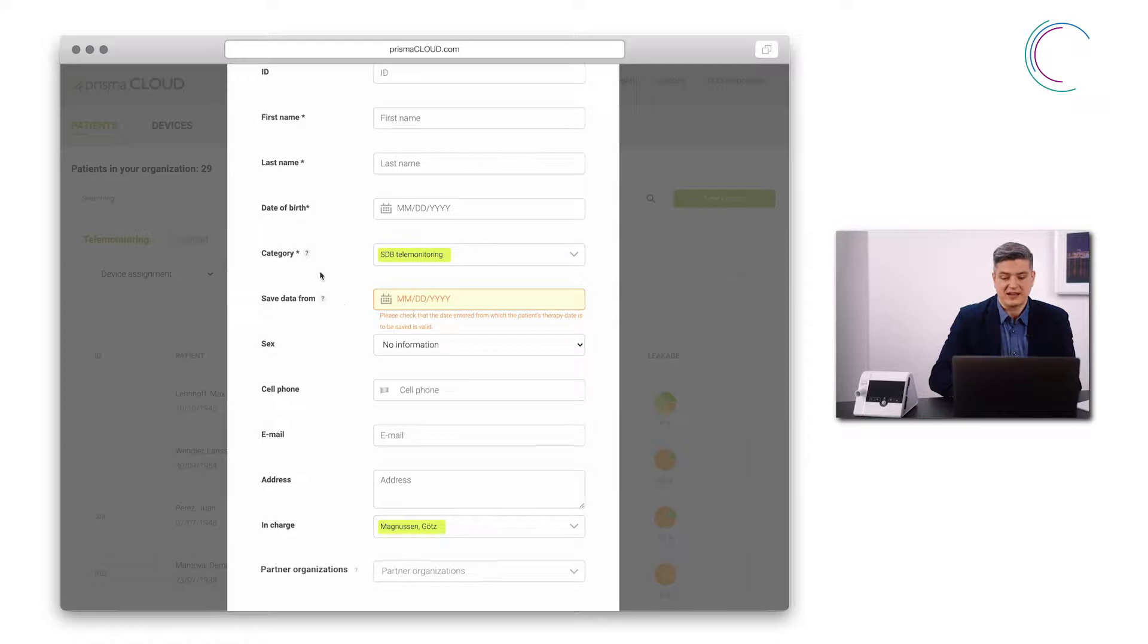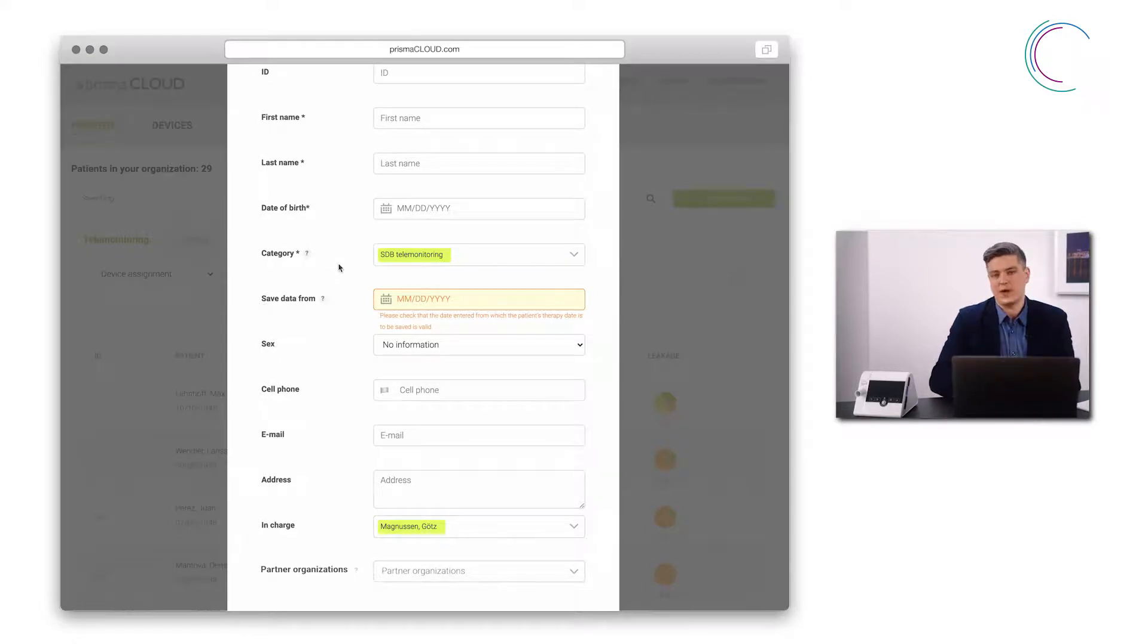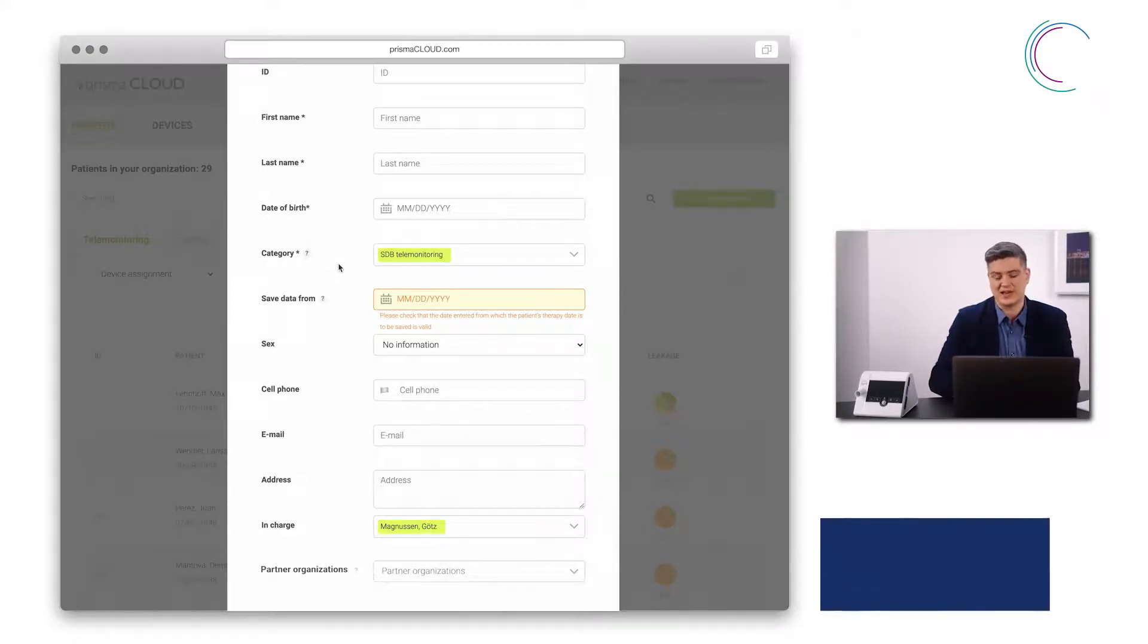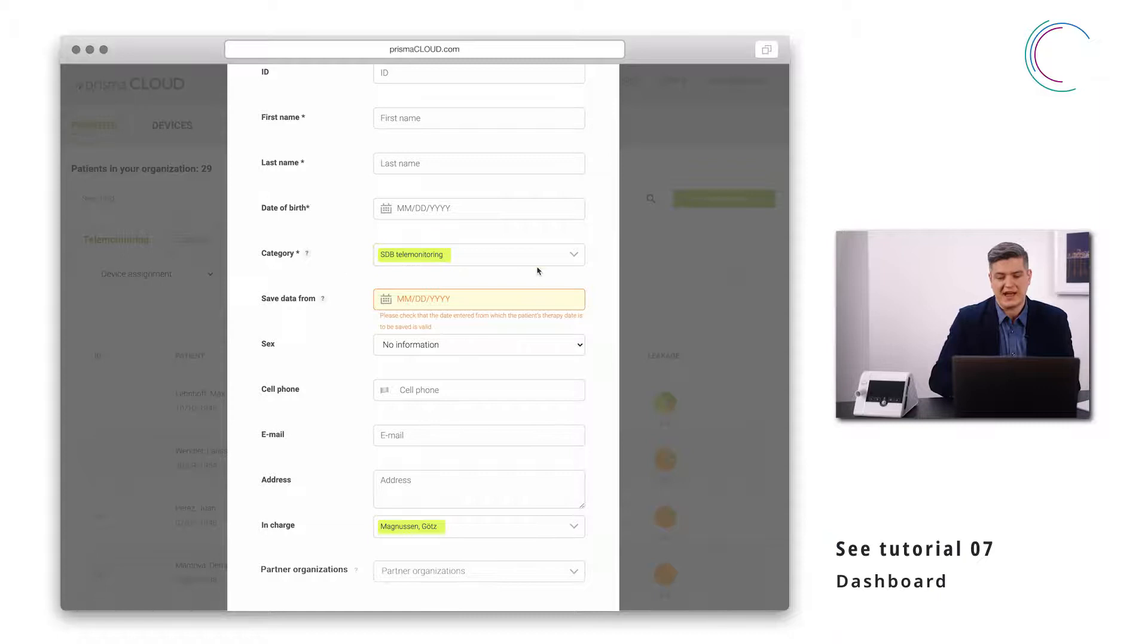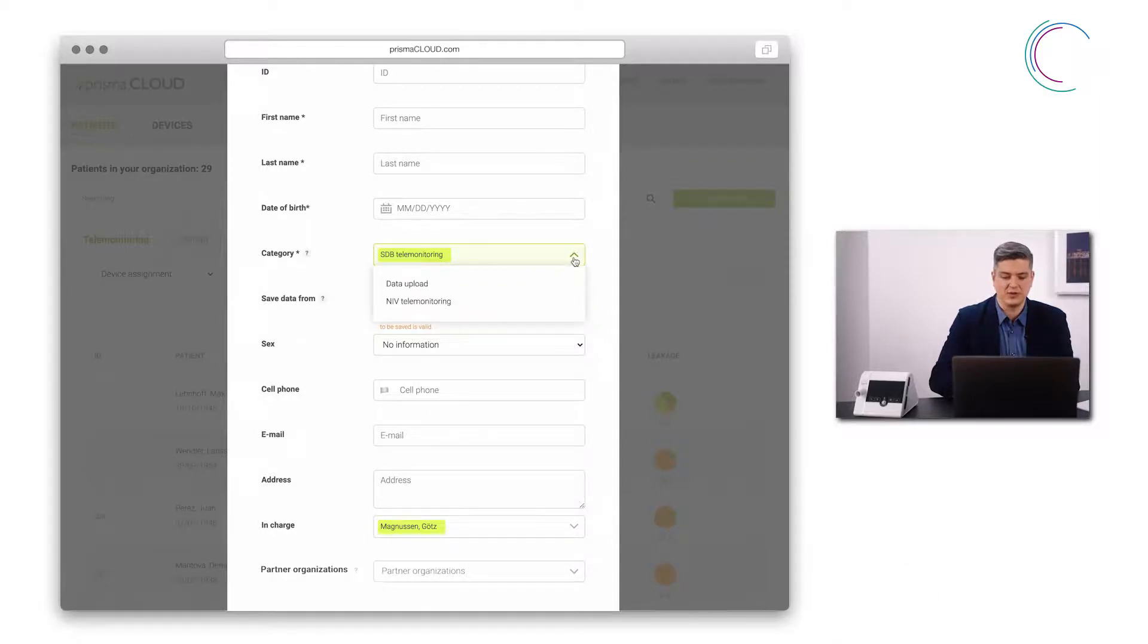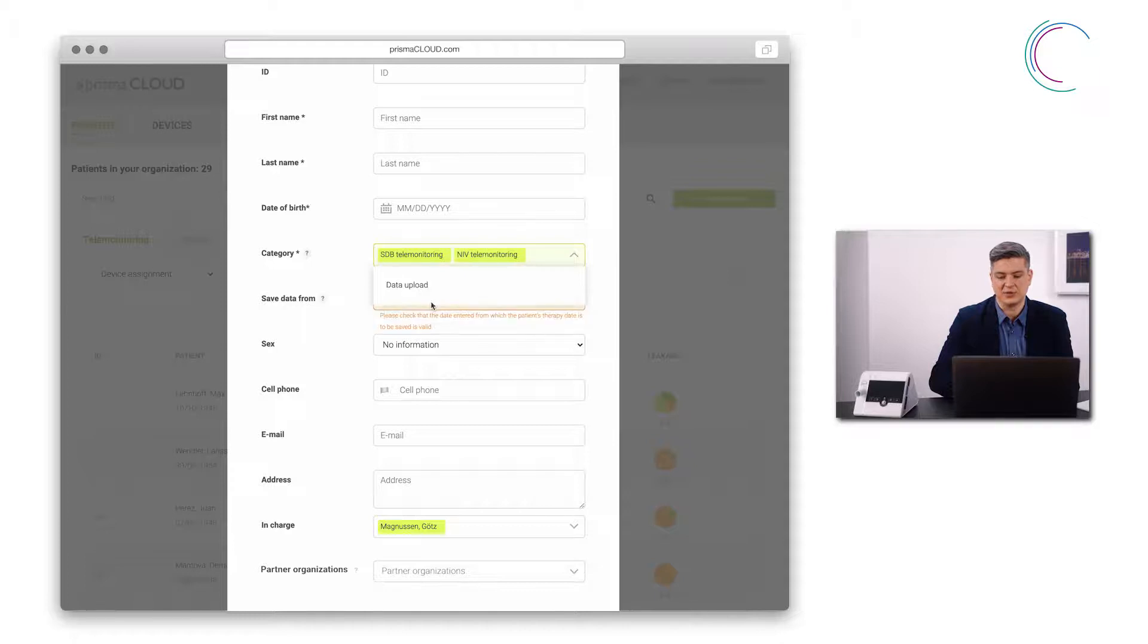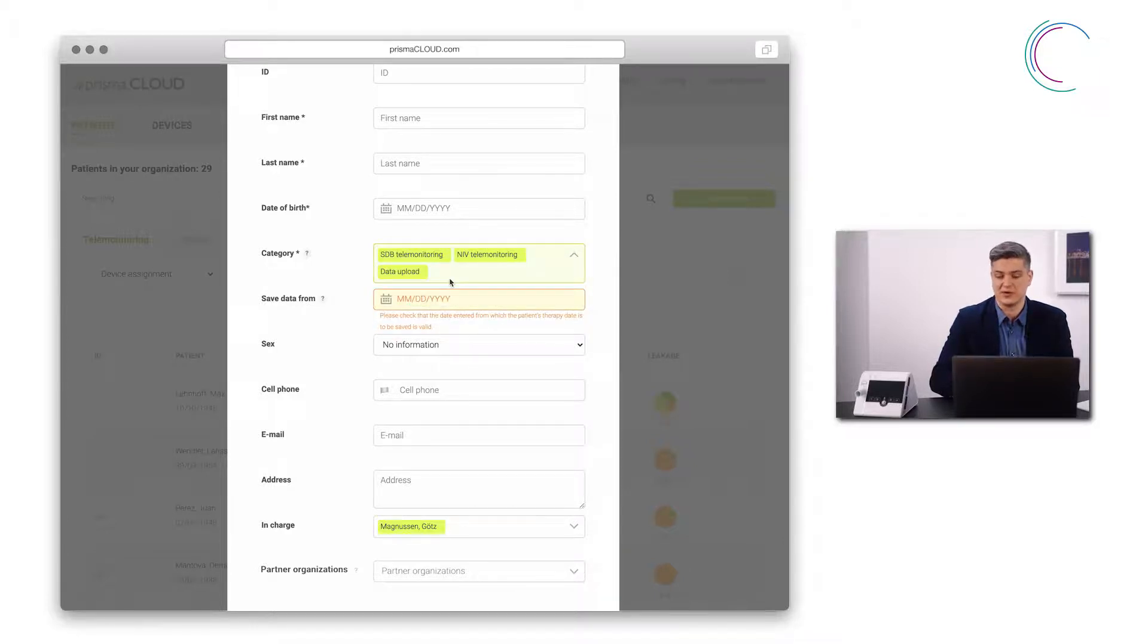With category I can define where my patient is shown in the dashboard. I have three categories to choose from: SDB telemonitoring, NIV telemonitoring and data upload. I can combine those categories.